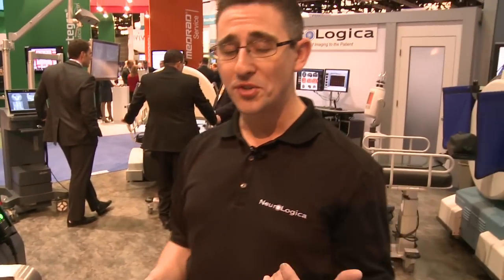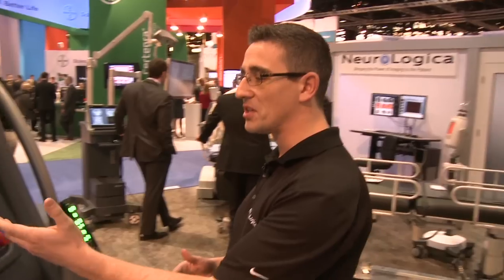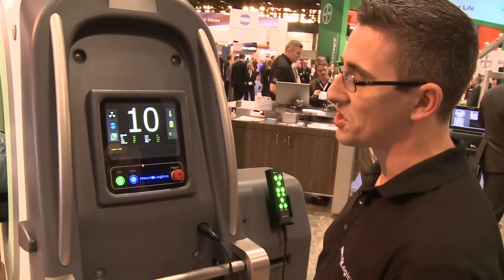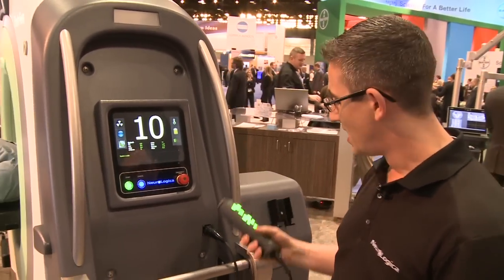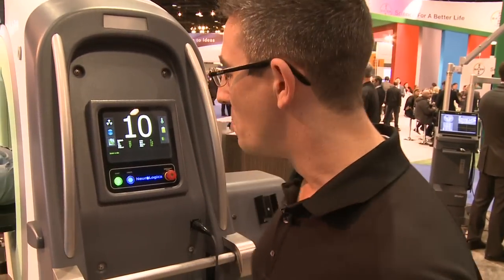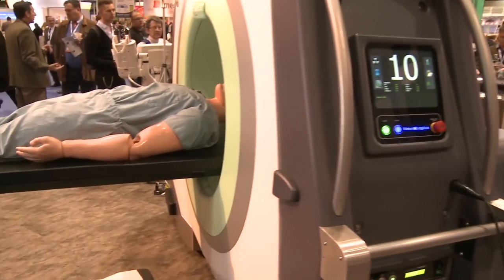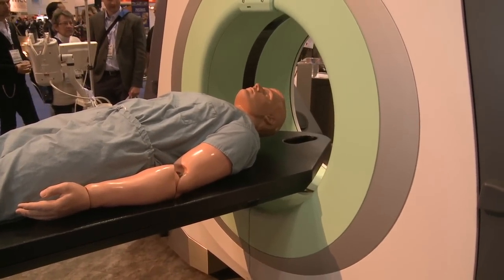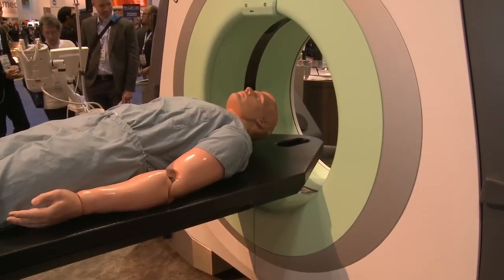When we say portable, we truly mean portable. BodyTom has two distinct transportation modes. The first is scan mode. As you can see here, our scanner is ready to scan. We have protocols, we have our indicators telling us our battery life and if we're ready to scan, and we are. When BodyTom scans, a simple touch of a button, BodyTom is going to move over the anatomy of the patient. With traditional fixed CT scanners, you're actually putting the patient into the scanner. BodyTom is the exact opposite of that.